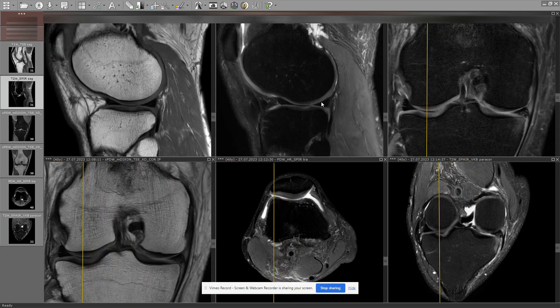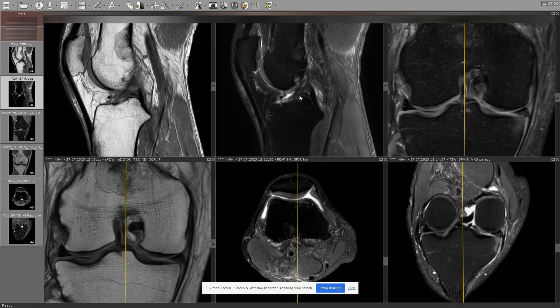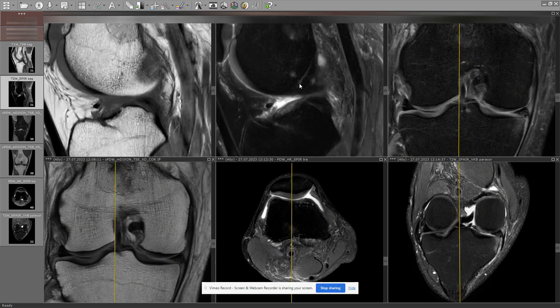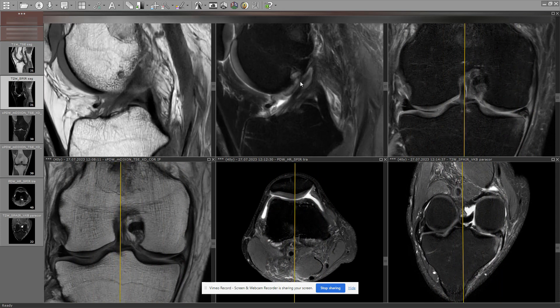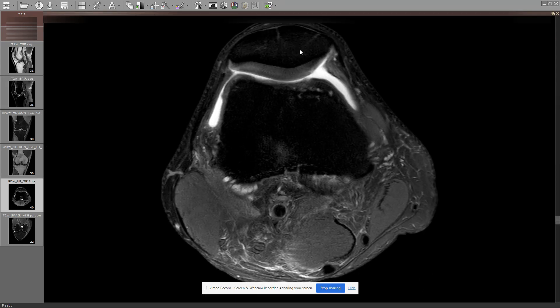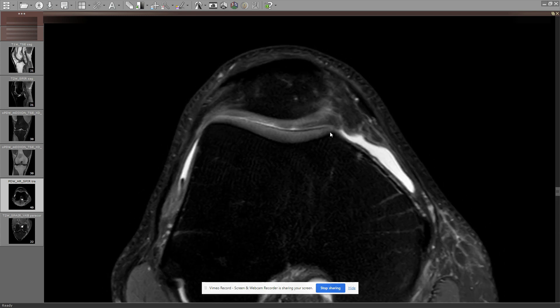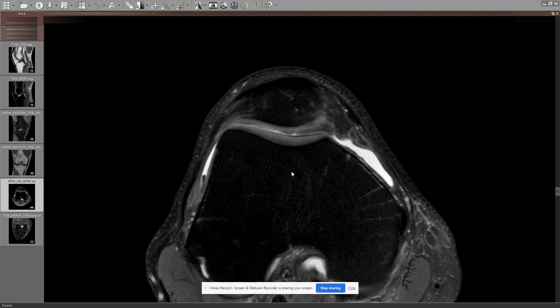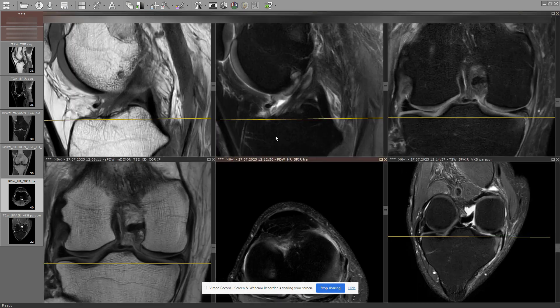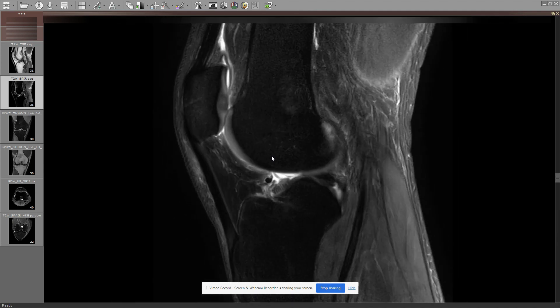The posterior condyles are fine too. We don't see any new things. Just a funny appearance of this intercondylar area. Then we go to the femoropatellar joint. Maybe there's a little bit of fraying of the cartilage right here — this is something I didn't describe, I said there were no cartilage defects — so maybe just some superficial fraying. Trochlear femoral cartilage is fine. No relevant effusion.